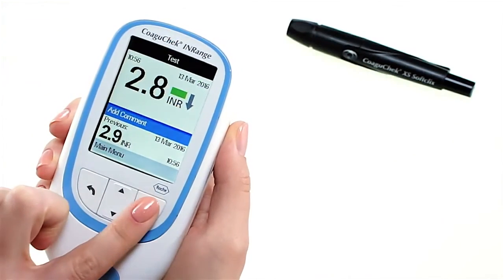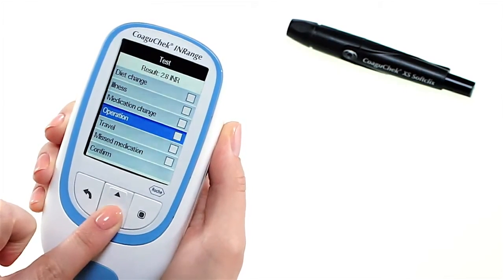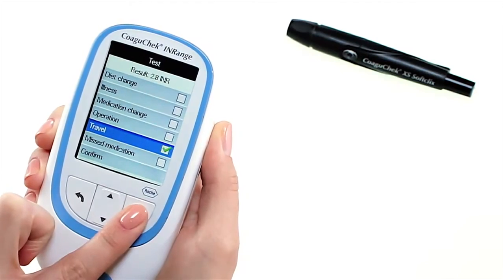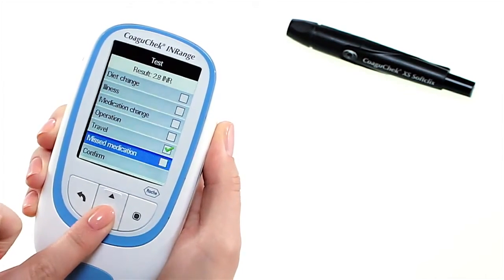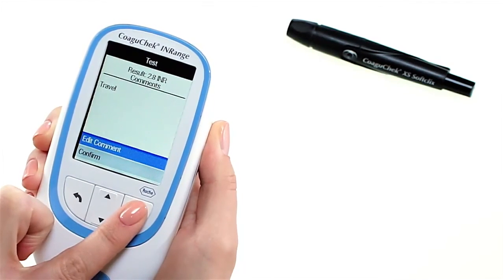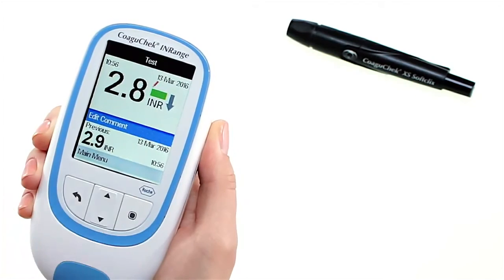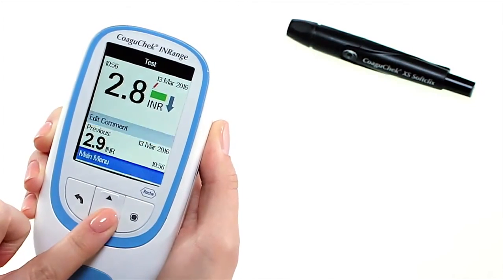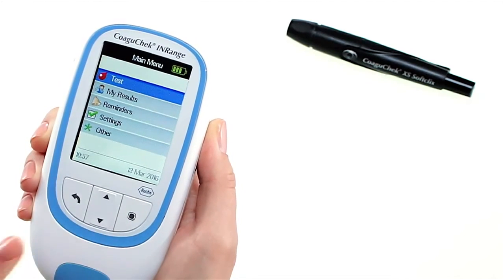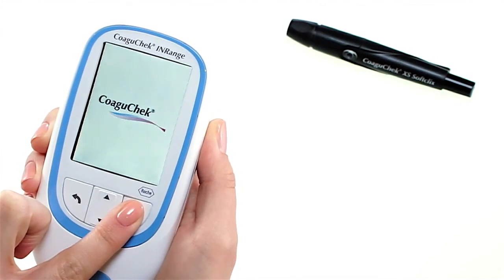If you wish, you can add up to six predefined comments to a test result. Comments can, for example, provide additional information about the test conditions or your general state of health to help you understand what could impact your result. These comments can only be added immediately after the test result is displayed and before the meter is powered off. It is that easy! Press and hold the enter button until the meter powers off.